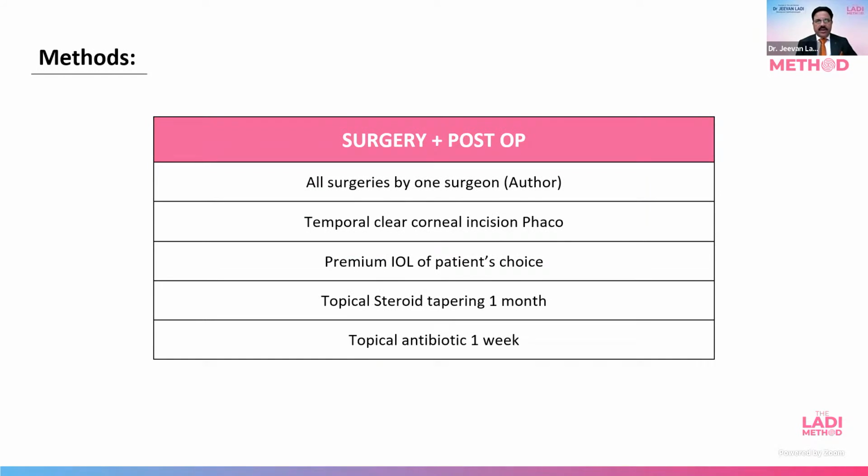Post-operative protocol: all surgeries were done by one surgeon, that is the speaking author. Temporal clear corneal incision phaco was done. Premium IOL of patient choice was selected. Topical steroids were tapered over a period of 1 month, and topical antibiotics were given for 1 week.